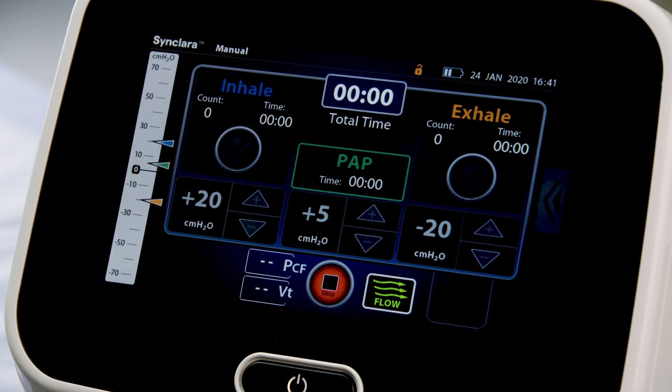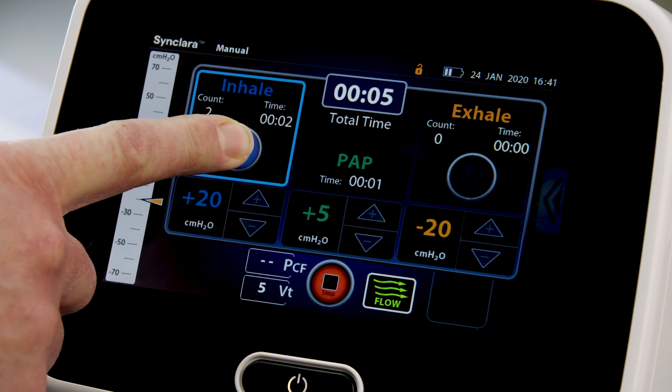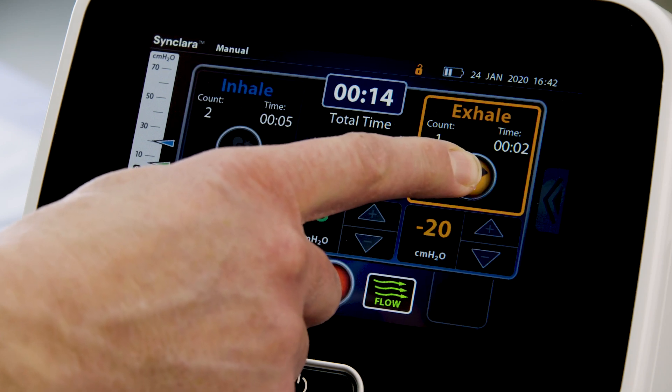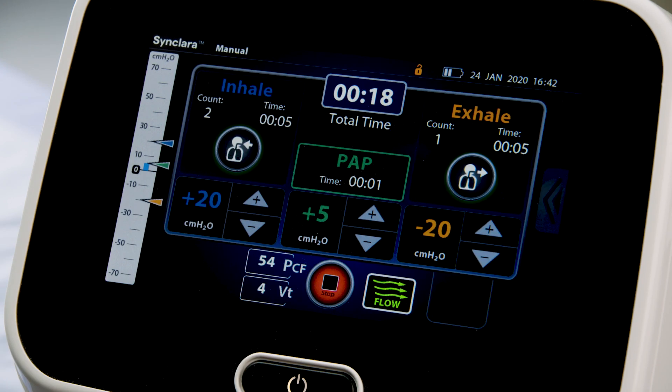Press Start. When the air pressure is ready for therapy, the inhale control is lighted. Press and hold the inhale control for 0 to 5 seconds as directed by the clinician to deliver the inhale stage. Then press and hold the exhale control for 0 to 5 seconds as directed by the clinician to deliver the exhale stage. During the inhale stage, have the patient breathe normally until lungs fill to capacity; during the exhale stage, have the patient attempt to cough or huff.